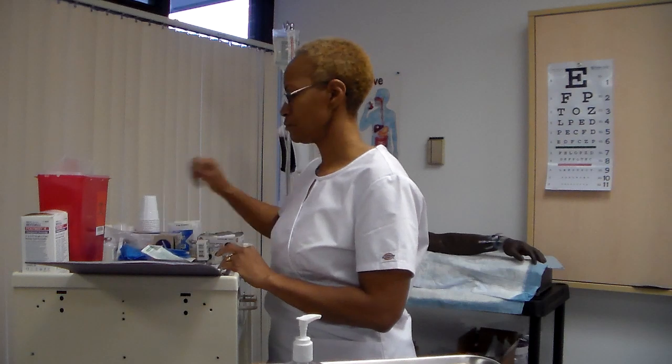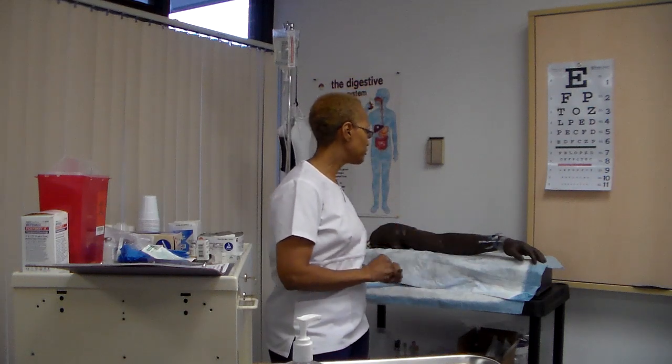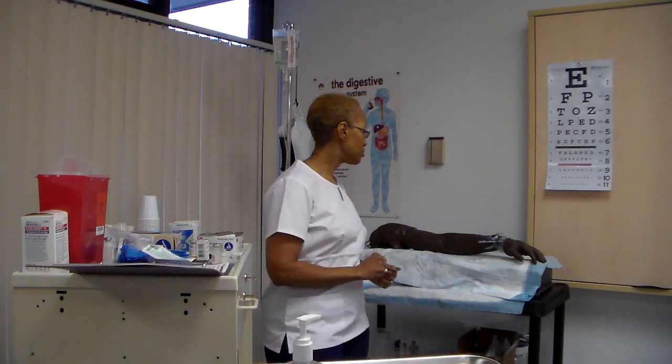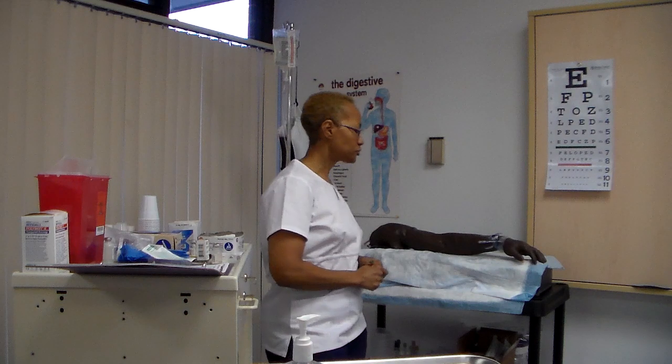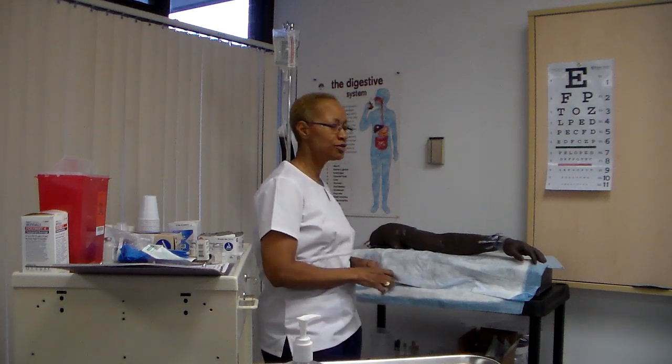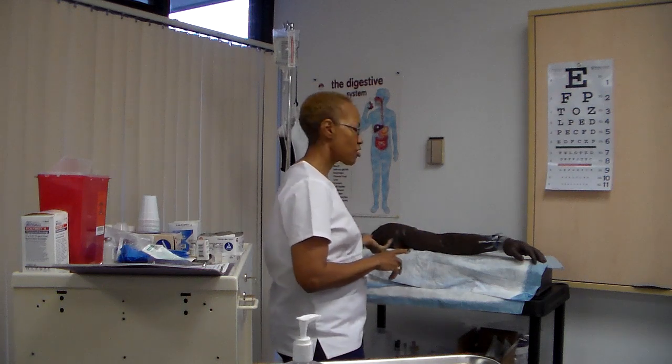Perform standard steps, assess IV or saline heparin lock, insertion site for signs of infiltration or phlebitis. Okay, so before preparing your medication, you're going to go into your client's room and assess the site, making sure that there's no signs of phlebitis, that it's infusing without any problems, they're not complaining, it doesn't feel cool to touch, that your site looks fine. You're going to talk to your client while you're in there. You're going to educate your client, letting him know that you're going to give a medication through the present line that they have, whether it's a heparin lock or an infusing IV, and educate them on that medication.